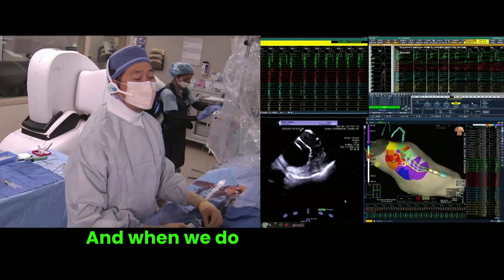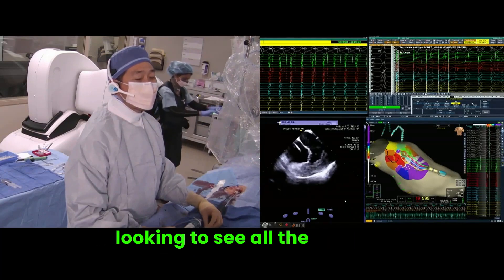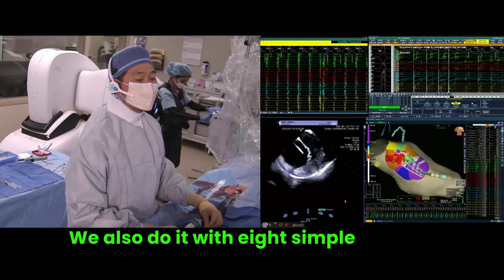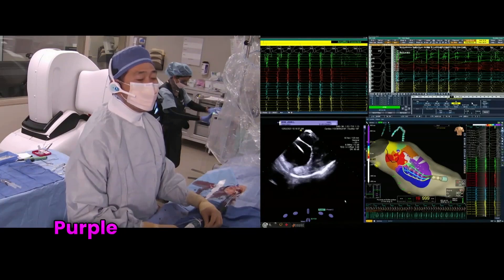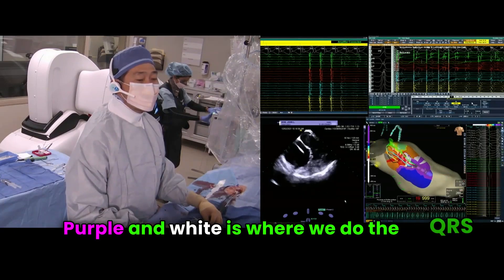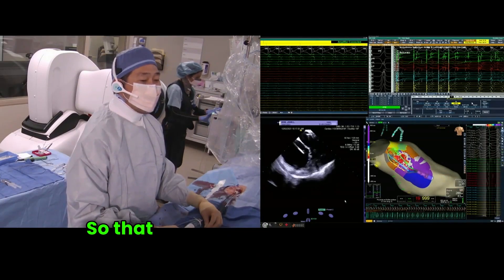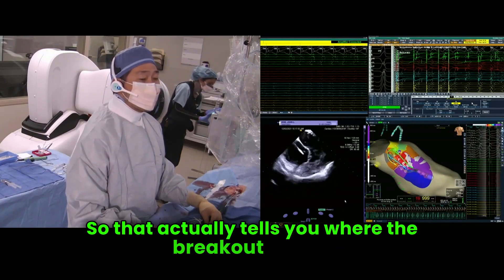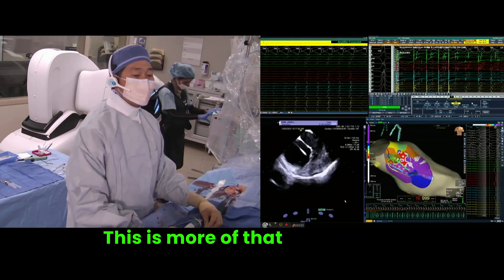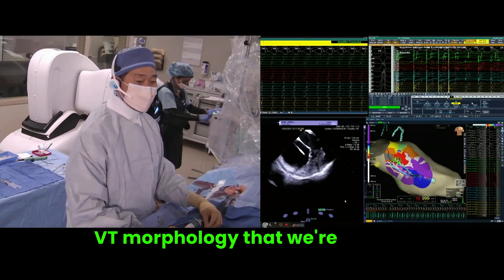When we do VT mapping, we're looking to see all the colors. We also do it with eight simple colors. Purple and white is where we do the QRS onset, so that actually tells you where the breakout site is. This is more of that Parahissian VT morphology that we're seeing.